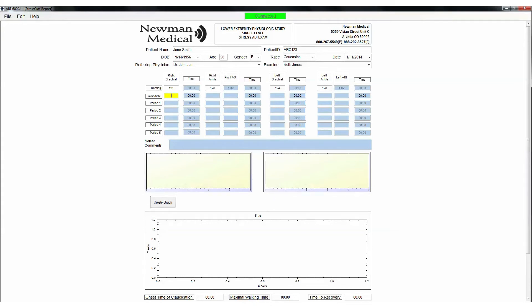Immediately following exercise, return the patient to the exam table and quickly obtain ankle pressures. Start with the ankle of the most symptomatic leg, then go to the other ankle, then to the arm that had the higher arm pressure. Repeat ABIs at 2-minute intervals until pressures return to pre-exercise levels. Post-exercise PVR waveforms may be useful and may be obtained by pressing the waveform button when the cursor is in an ankle location.